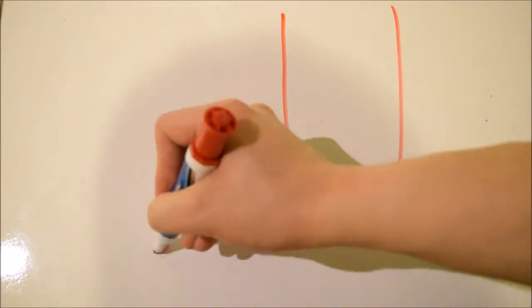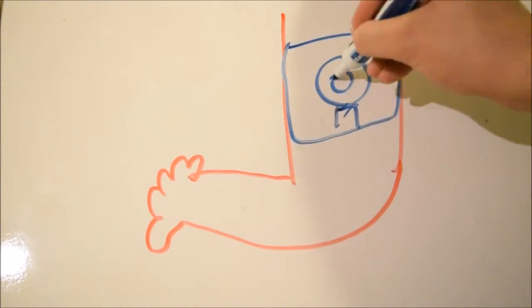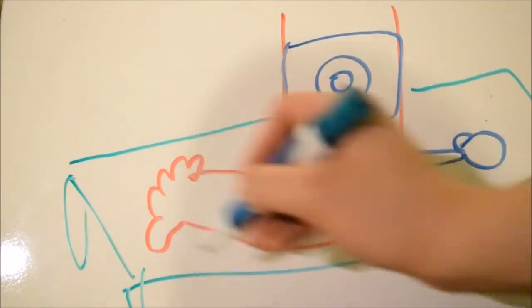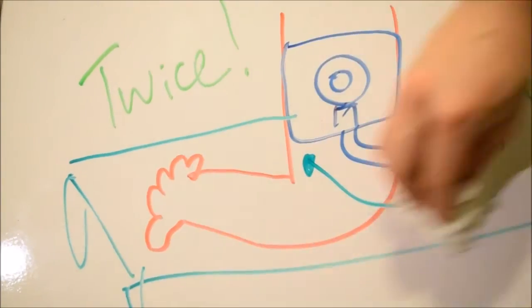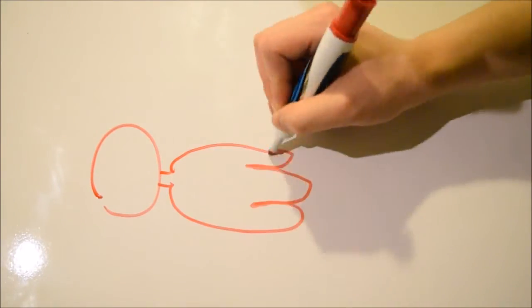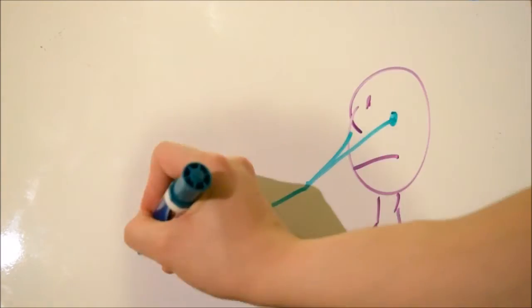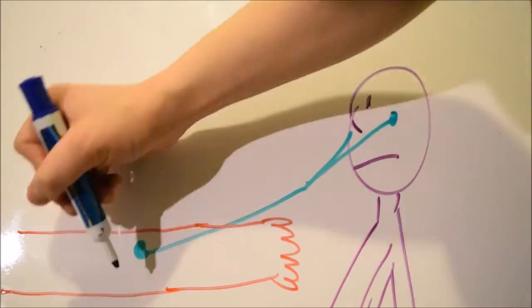The next part will be exactly the same as the previous, except it will be done on the right arm instead of the left. All the following parts will also be done on the right arm and will be done twice. For the next part, the subject should be lying down and should try their best to stay as relaxed as possible. Now, with the blood pressure cuff on the subject's right arm, begin the recording of the blood pressure as done previously.